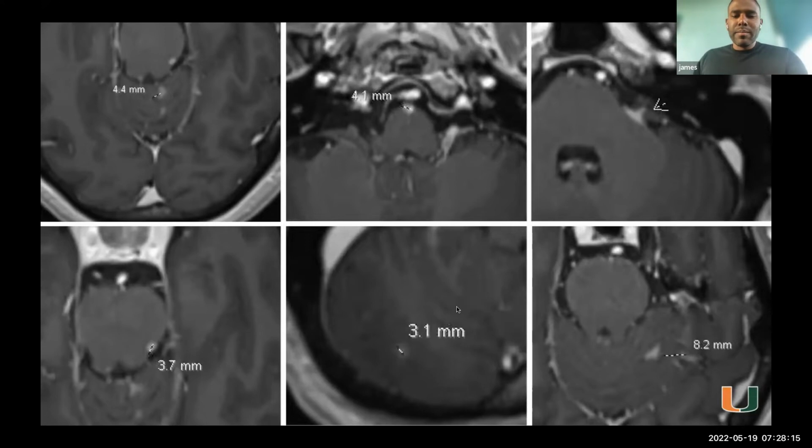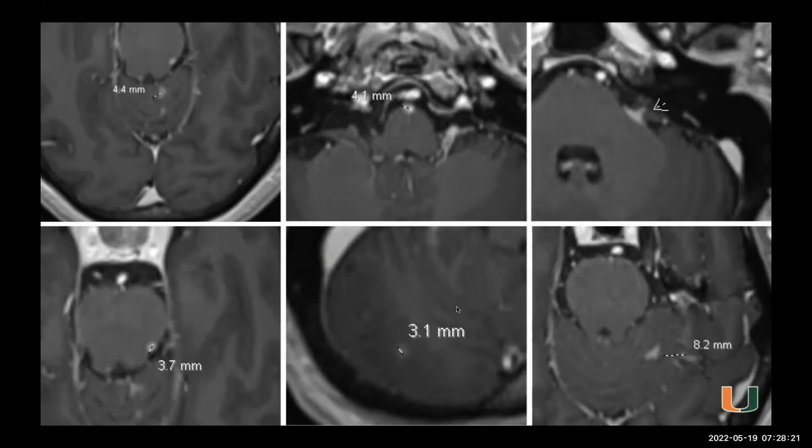Okay. All right. And then if I showed you these slices on that same MRI, multiple sub-centimeter lesions. I would be thinking, yeah, so now my differential changes towards metastasis, versus just a macroadenoma, meningioma, or craniopharyngioma, which are the things I'd be thinking of prior. Maybe lymphoma is also now in the differential. For me, she uses cocaine, so maybe she also has other drug use as well. So maybe lymphoma, and you'd check for HIV. Yeah, that'd be my primary differential for this now.